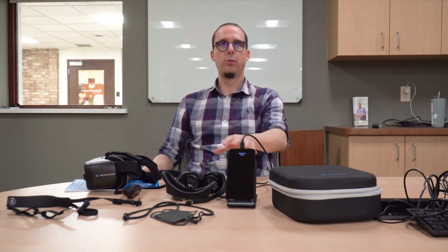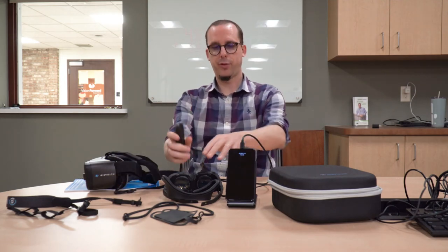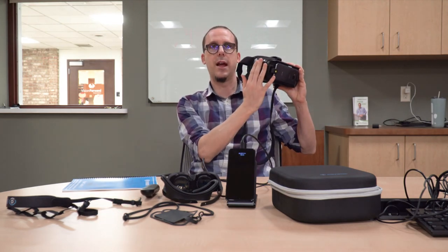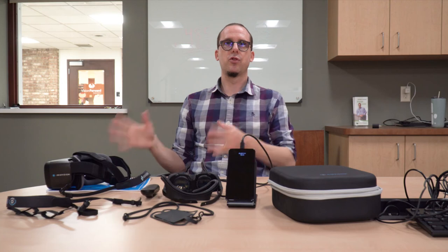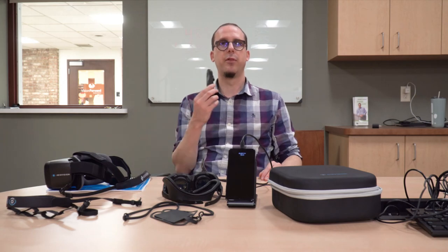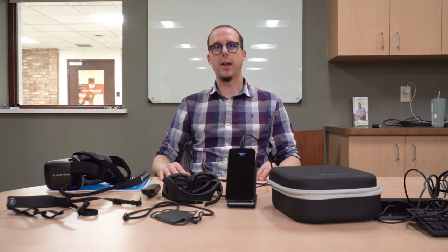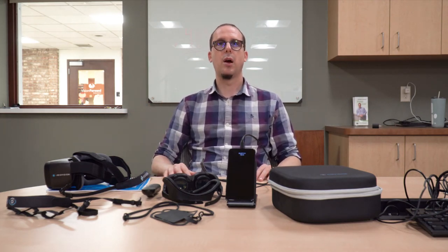In terms of operation, I prefer the Inspire because we have different ways of operating it - the remote control, buttons on the headset, and voice commands. IrisVision Live has voice commands and controls on the right side of the headset, but if you don't have use of the right side of your body it's not going to be very easy to use. With the Inspire, the remote control can be used with either hand. It's also just more convenient to have a remote control to operate the device in general.